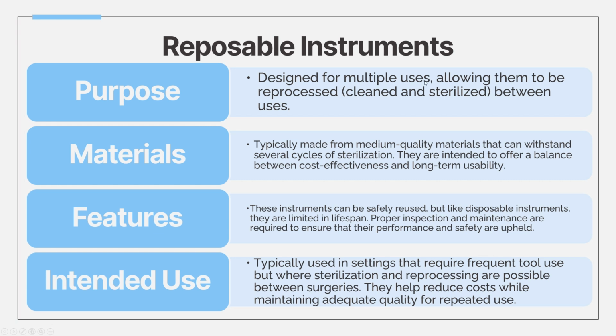Next one is reposable instruments, and the purpose of this is they're designed for multiple uses, reprocessed, that is cleaned and sterilized between uses.